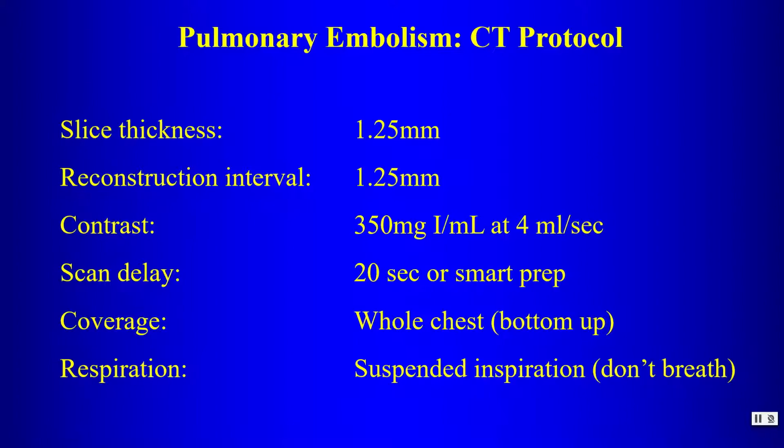As far as the instructions for respiration, we want to give the instruction of stop breathing or don't breathe. What you want to avoid is you don't want the patient taking a deep breath right before the CT scan, and then we'll talk about the reasons why in a few minutes.